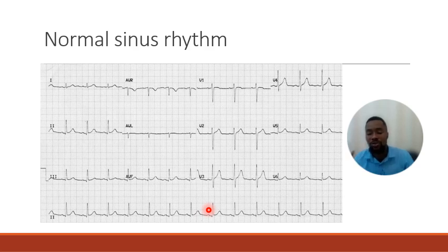So that means I will not say 300 divided by 3. I will say 300 divided by 3.6, because I still have 3 small boxes. I just need to know the value of the 3 small boxes, not dispose of them. If they give you and me 1.3 million now, will you throw away the 300,000? No, you will look for the value of the 300. So the 3 small boxes, because you're using big boxes, doesn't mean they don't have a value. They are not up to 1, but they have a value, and that is 0.6.